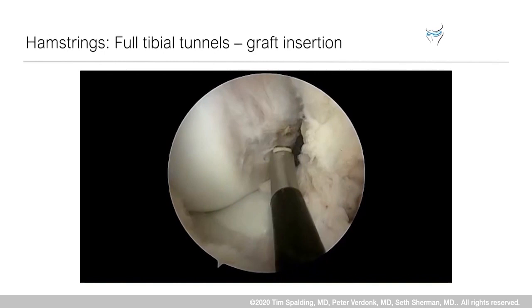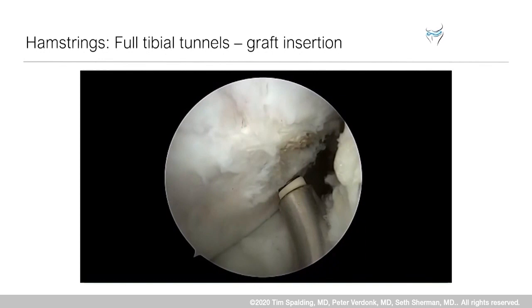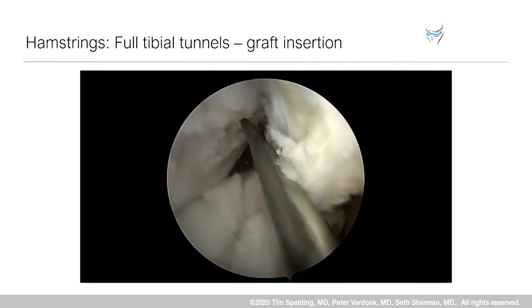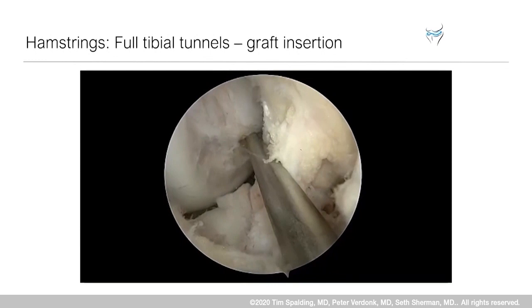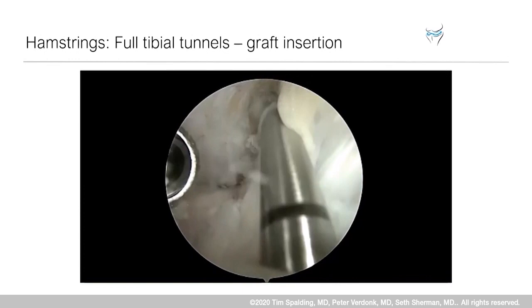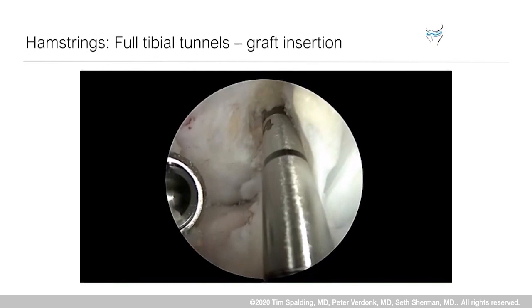This is the ACL reconstruction: removing the old ACL or preserving the stump if possible, then viewing from the anteromedial portal using the RF probe, referencing from the deep aspect of the notch. We position the femoral tunnel between the mid-bundle and AM bundle positions, erring more towards the AM to capture appropriate fibers using the microfracture pick, then bending the knee into full flexion for accurate positioning. This uses the spade tip guide wire, which hooks on the femoral condyle once it passes through the femoral cortex.